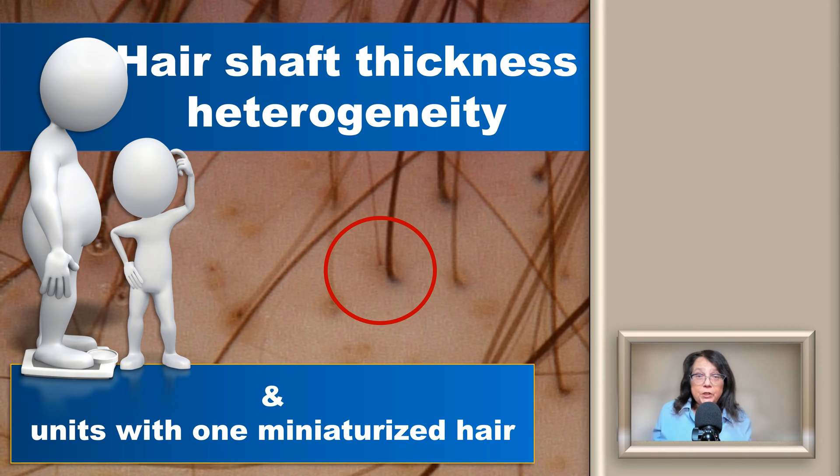Here is a trichoscopy image. When you look at the red circle, you will see one follicle unit with one thick hair and one thin hair. The thin hair is undergoing miniaturization and will continue becoming thinner, shorter, and more hypopigmented until it develops into a small vellus hair. Looking at the broader picture, you will see hairs of normal thickness, some thinner, and some very thin — this is the hair shaft thickness heterogeneity typical for androgenic alopecia.